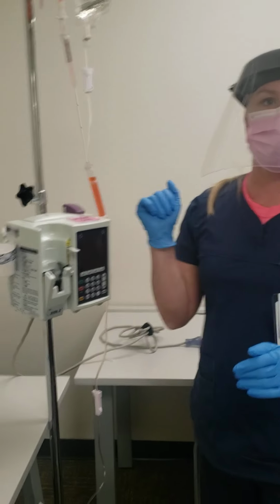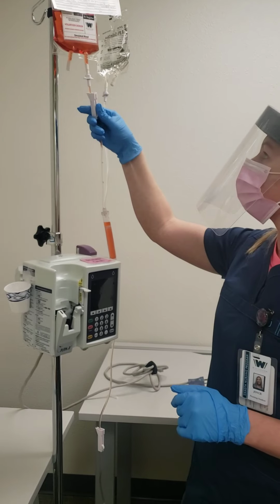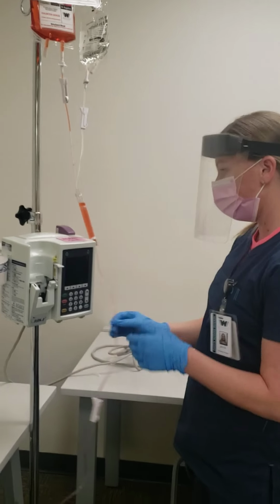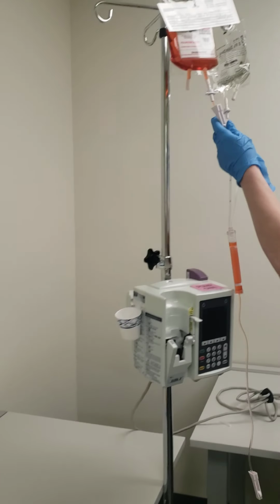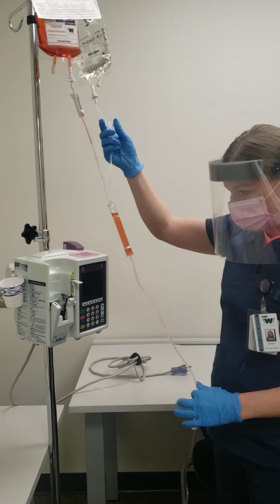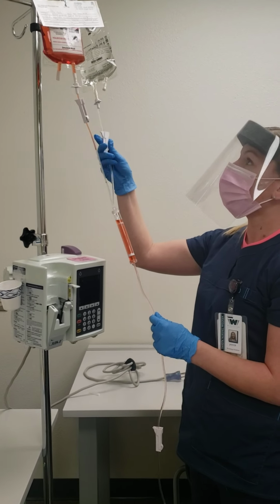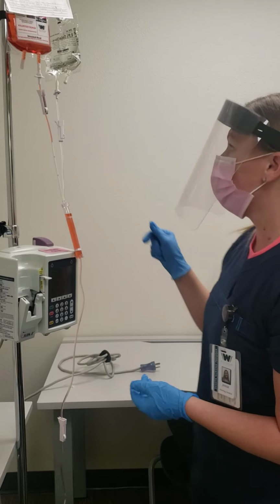So after stopping the infusion, I would take a stopping set of vitals for Samantha, just to make sure she's not having any adverse reaction. Before I do that, I'm going to flush the tube with normal saline before I stop, just to make sure to get all of the products out and make sure she gets the full amount of her transfusion. Okay, and then I would get her stopping vitals after discontinuing.